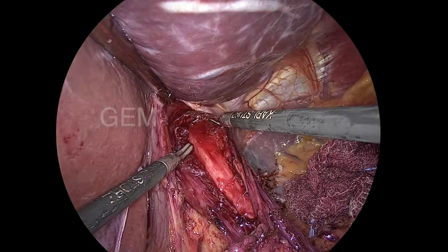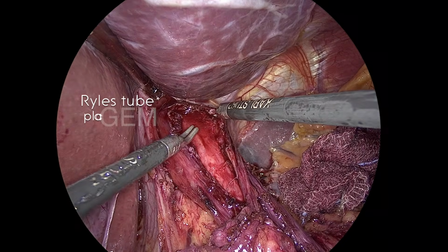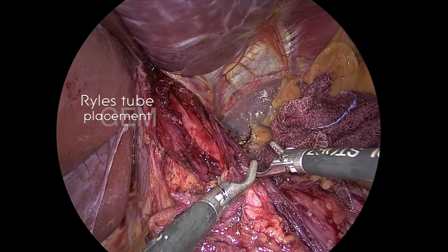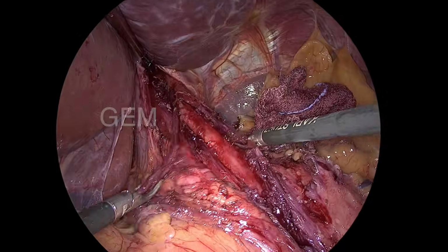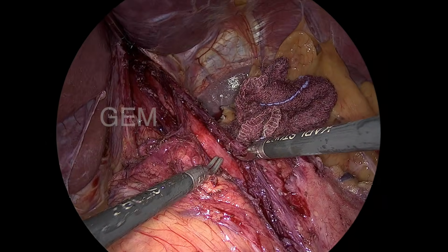If any bleeding is there, I don't apply cautery. Now I am inserting the Ryle's tube. I ask the anesthetist to introduce it very slowly. Most of the time they introduce it very fast, so I ask them to slow down and go under vision, otherwise they have to push. Now I am guiding with my left hand forceps.